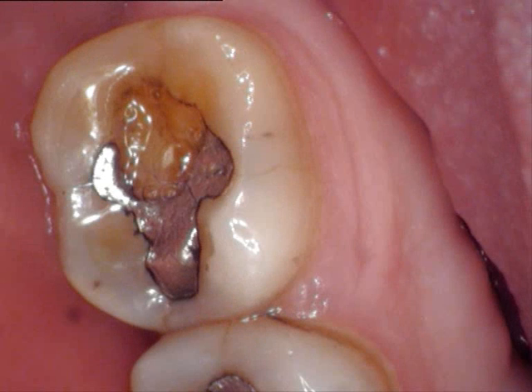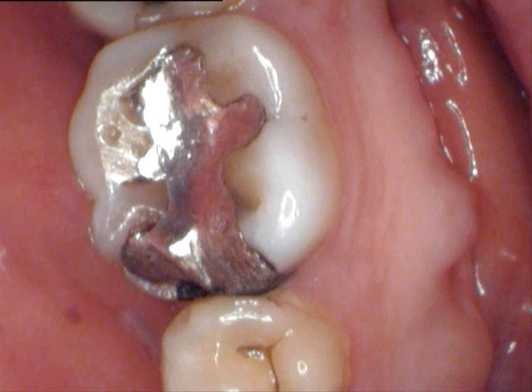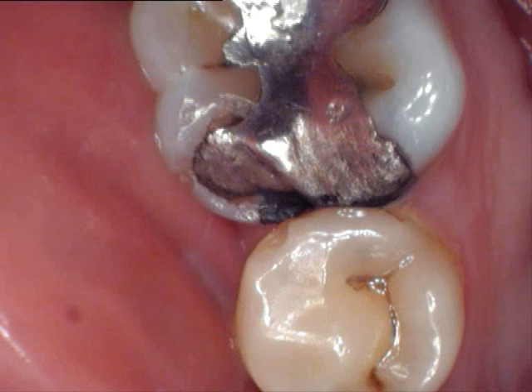It's quite common for patients who have had previous amalgam fillings to show signs of wear, pitting, or damage after many years, not to mention decay around the edges. You can see in this particular tooth there's some decay around the front of the filling. With a close-up we can also see ditching around the margins and breakdown. This filling is no longer doing its job.